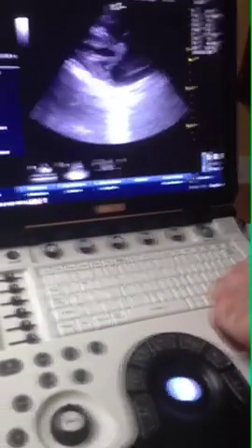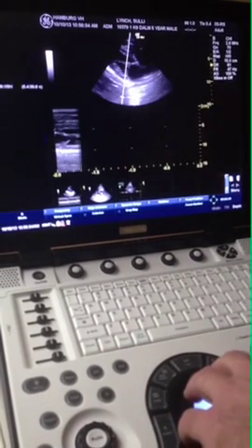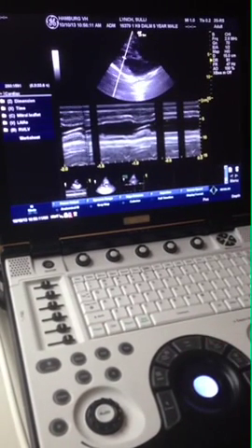We start with a four-chamber long axis. This is our happy place — this is where we're going to go back to if we get lost or get off angle. And I'm going to start with my measurements right away.